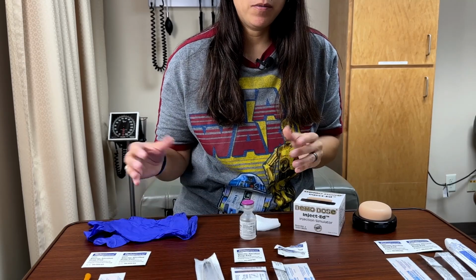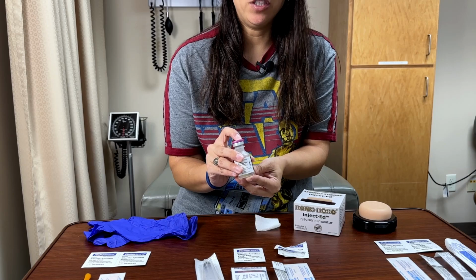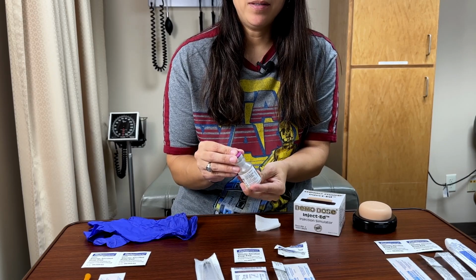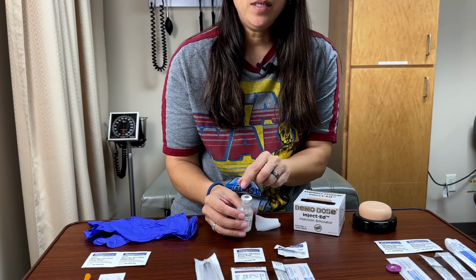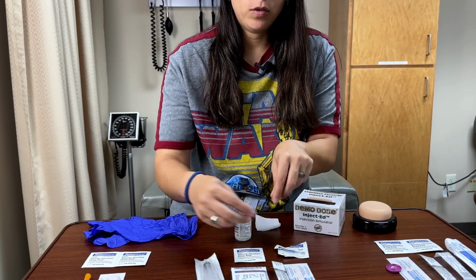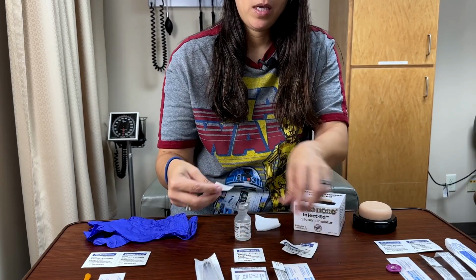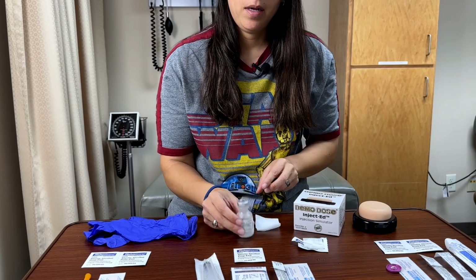We want to put on our gloves before we do this, and the first thing we're going to do is take our vial of medication. Usually it has a plastic lid on the top, and we'll want to pop that off. It usually just pops off. Technically, everything underneath here is sterile, but we want to wipe it off. So we'll open up a sterile prep pad and wipe off the top. Then we dispose of that prep pad. Now this is ready to go.